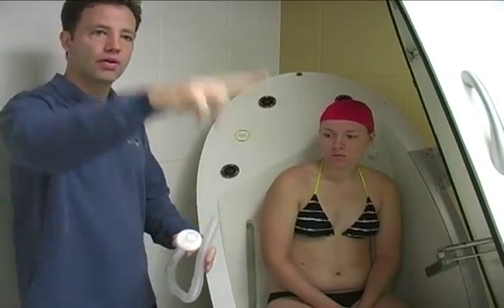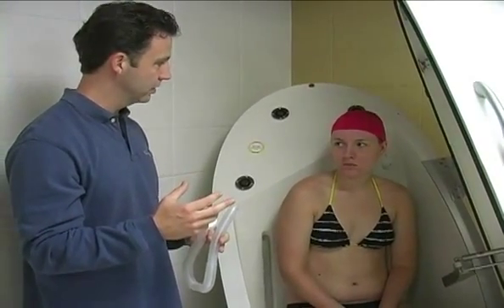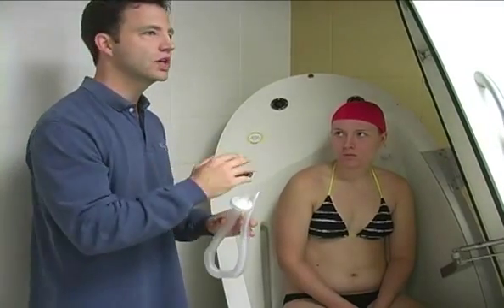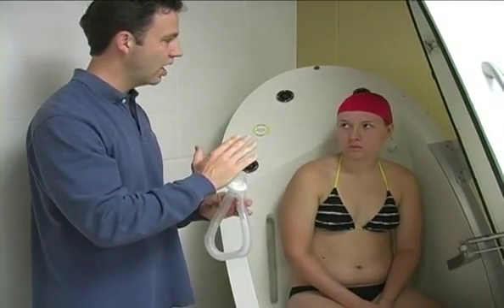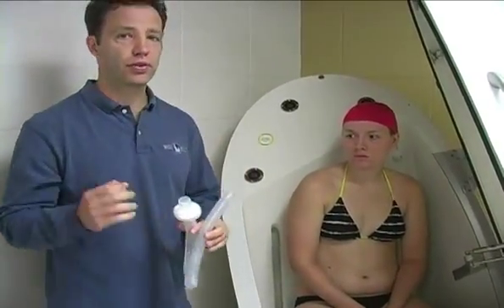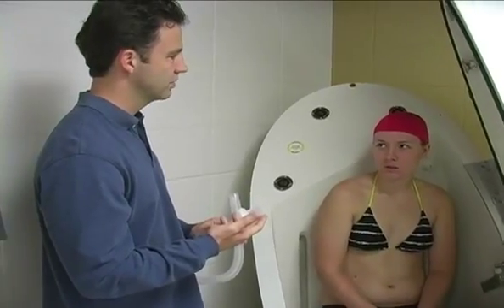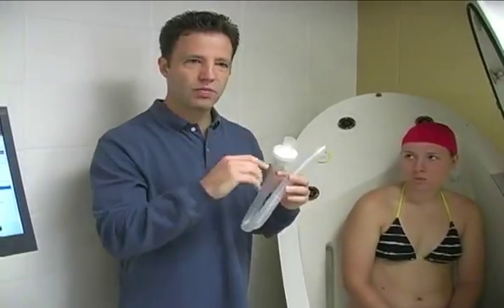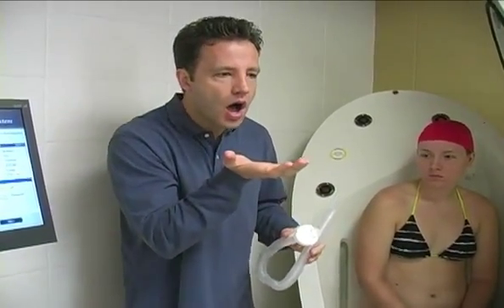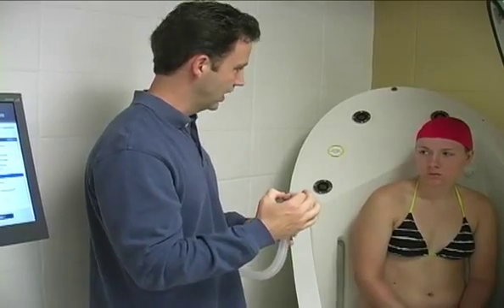There'll be a bar that goes up and down. And then it will say prepare to huff, okay? And that is your signal to not huff yet, but get ready to huff, okay? And then it will prompt you to huff. And I want you to huff 3 times. It's similar to, did you wear glasses? Sometimes, okay. So if you wear glasses or sunglasses, you fog them up to clean them. So it's real light. It's not blowing out something like a birthday cake. It's out, out, out, 3 times. You can't huff too lightly, okay? So that's the maneuver. And then you're finished.